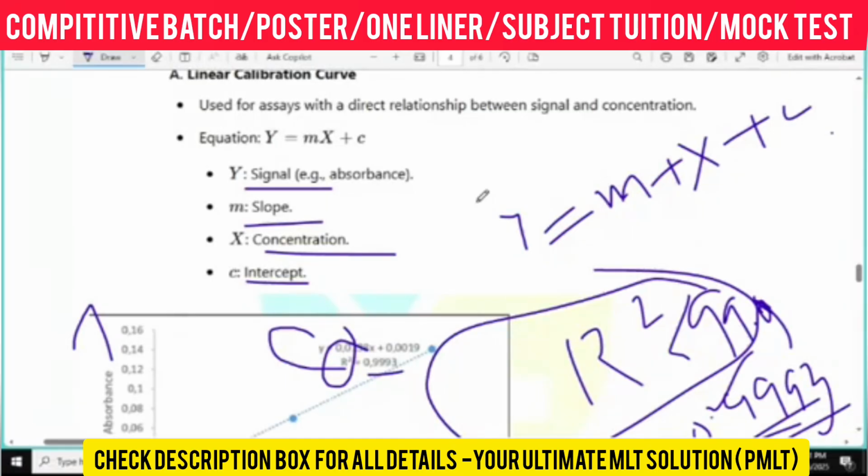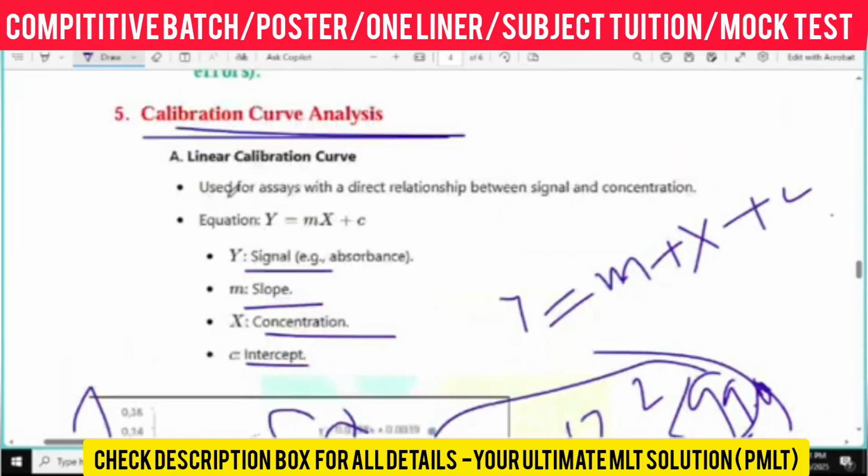If it's less than 0.99, then we cannot take the result. Okay, so this graph is a linear graph, because there is no curve shape. It is the linear graph or linear curve.